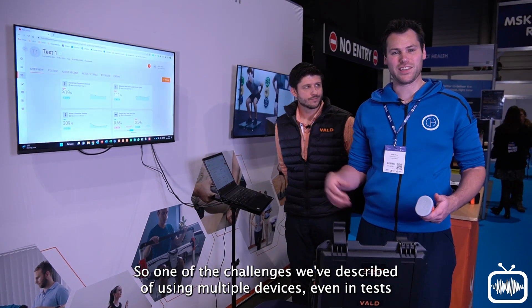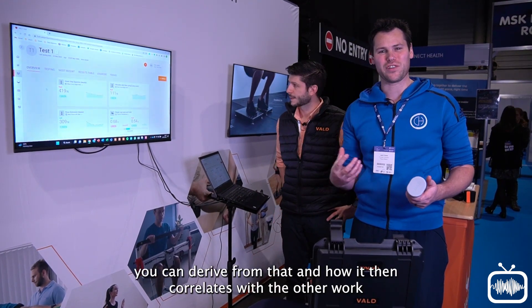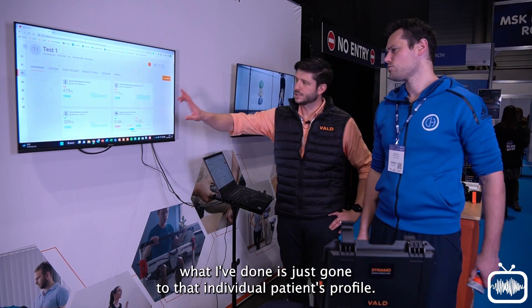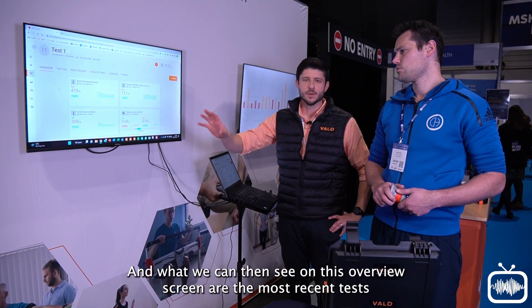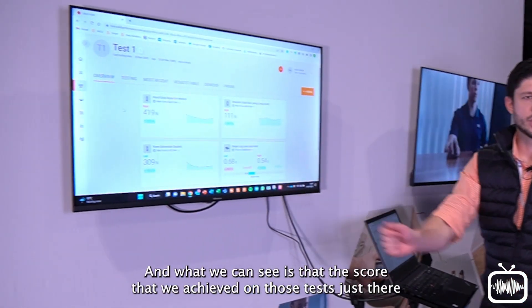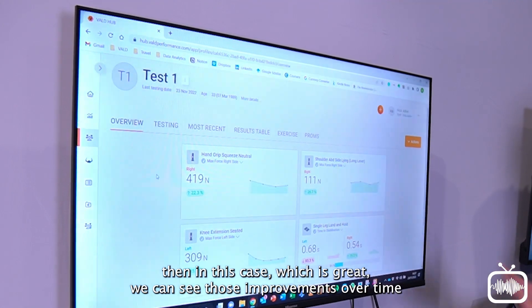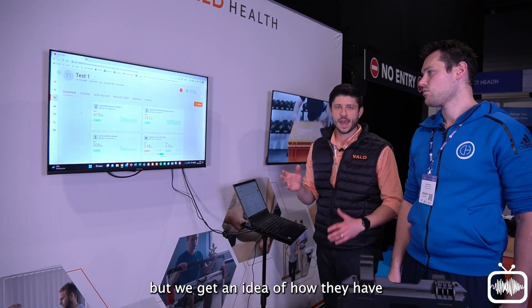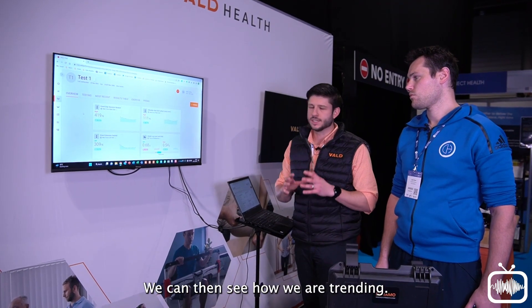One of the challenges of using multiple devices is what data you can derive and how it correlates with other work done with that patient, including what they did last time. On VALDhub here, I've gone to that individual patient's profile, and on the overview screen we can see the most recent tests completed — the three we've just done are there — as well as data from other VALD products. We can see the scores achieved and get a longitudinal view: in this case, we can see improvements over time, including a 22.3% increase, tracking how they've progressed over weeks, months, or many years.